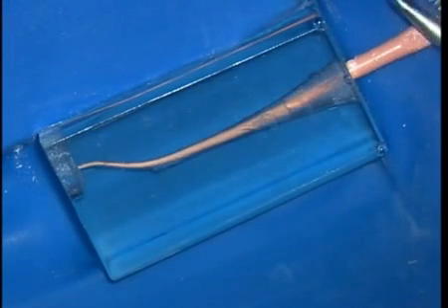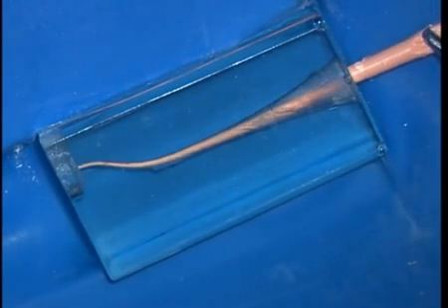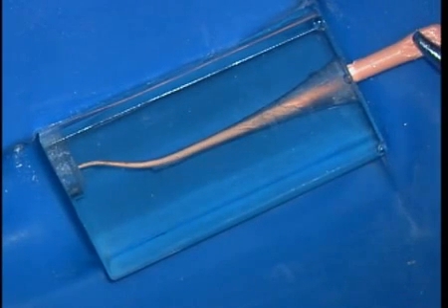Following the shaping procedures, notice that the ledge, although reduced, is still present. In Type 2 ledge management, it isn't always wise to try to remove the ledge in its entirety, or we could predispose the root to either a strip perforation or weaken the root and predispose it to a longitudinal fracture.